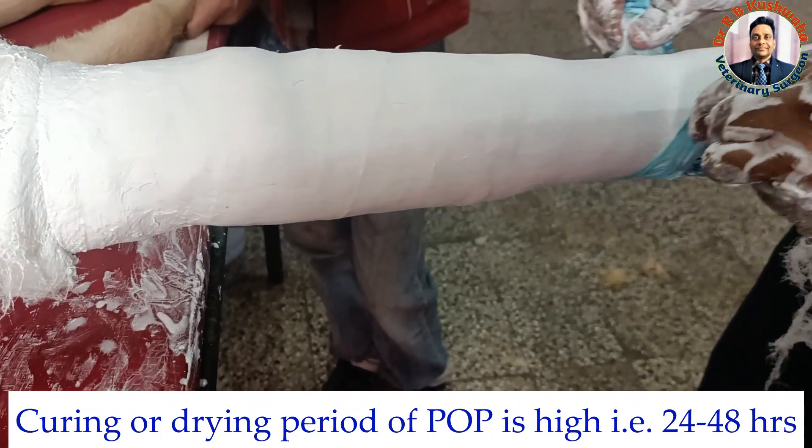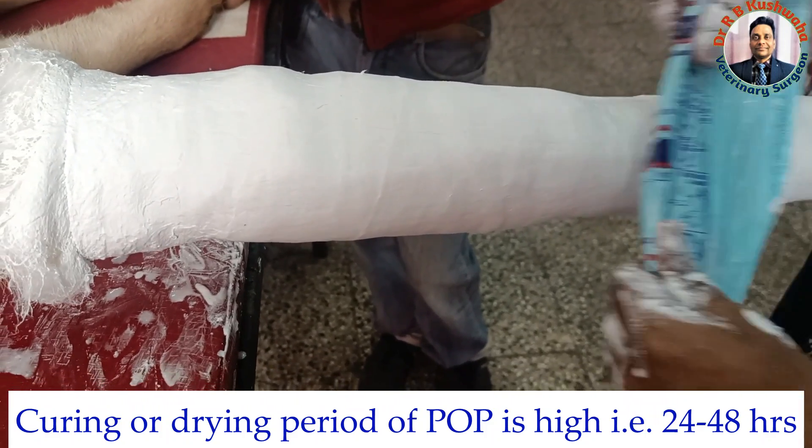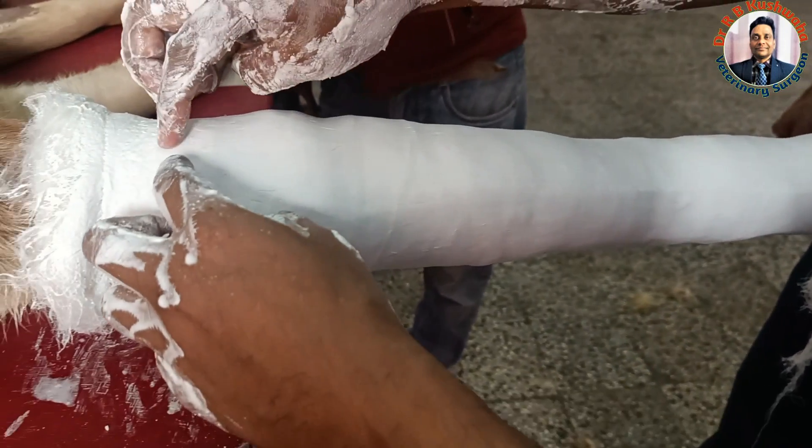The advantage with this animal is that its weight is light. Once the cast is dry, I will cut from here at the slip knot level.